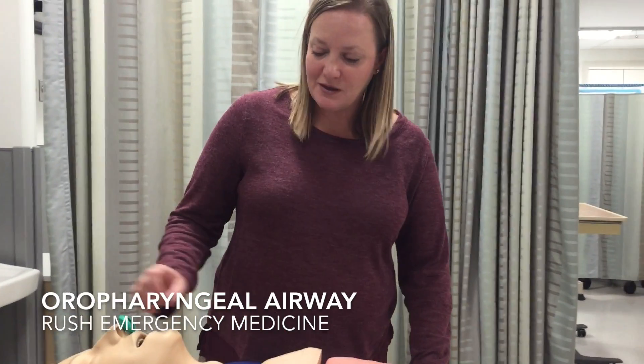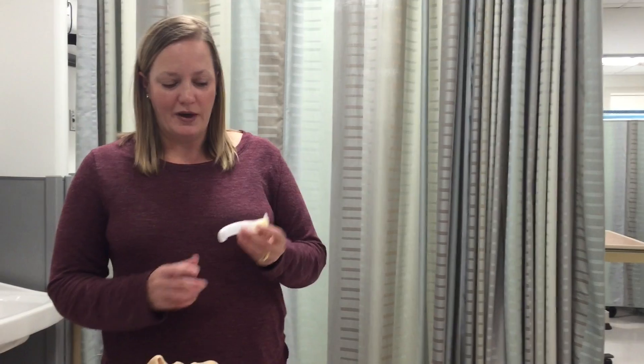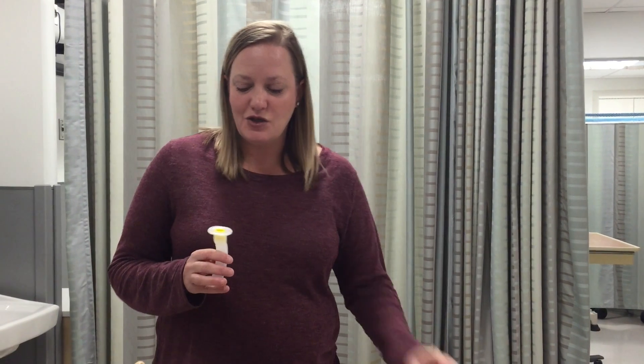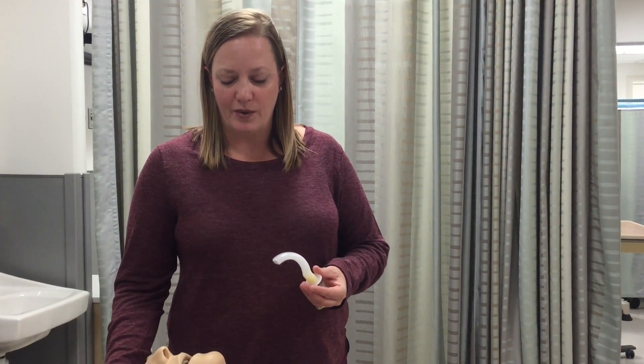For the more obtunded patient, we use something called an oropharyngeal airway. As you can see, this is a piece of hard plastic as opposed to the flexible rubber, and this is really only tolerated for patients who are really obtunded. It's a way to open the airway and get the tongue out of the back of the airway.